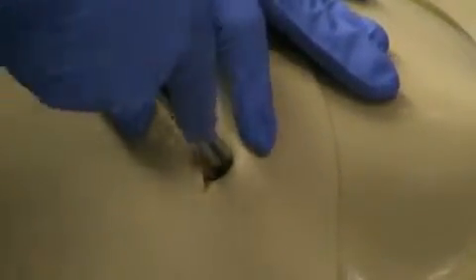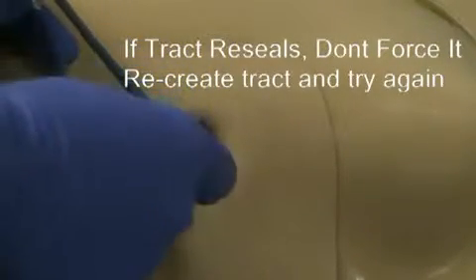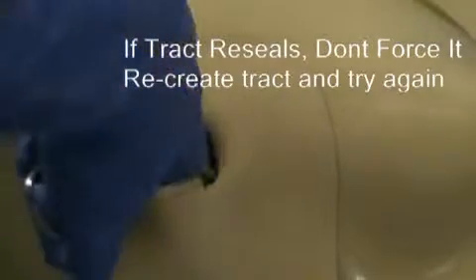Find my track again. And once I get my tube in, pull my clamp out, and insert my chest tube in. As you can see, I'm having a little bit of difficulty with this, and that's because my track actually collapsed somewhat as I was talking and demonstrating. If I have any problem with that, I can go back in with my clamp and just dissect those tissues once again and try again.